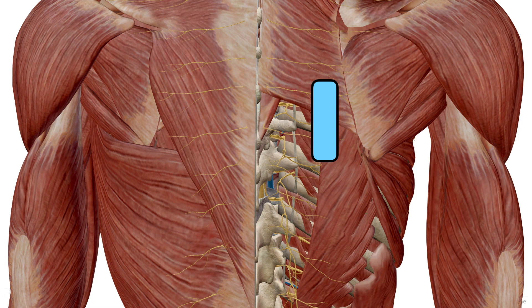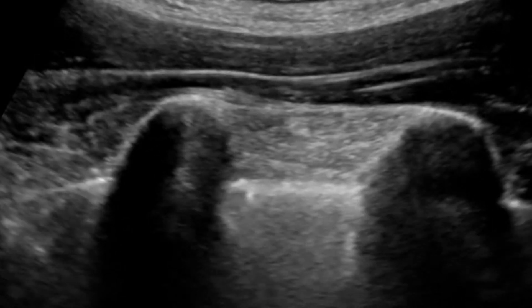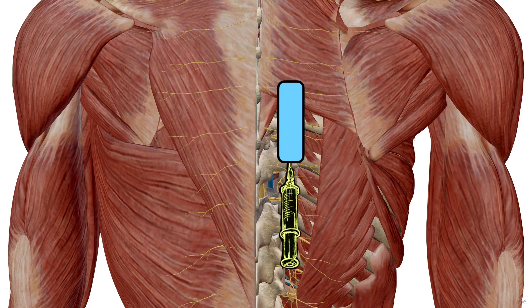In the thoracic region, the transducer is placed in the parasagittal orientation well off the midline. We want to start by imaging ribs, then slide medially until we see the transition to the transverse process. Here's an image of the ribs — you can see the rounded profile with pleura clearly sliding on either side, and as you move medially there's a distinct shift to a new structure. That's the transverse process, which is much more square in appearance, usually more superficial, and the pleura is less apparent or not seen at all. Once you have the image, a needle can be advanced from either direction — it doesn't appear to matter much which, so whatever makes the most sense for your ergonomics is best.